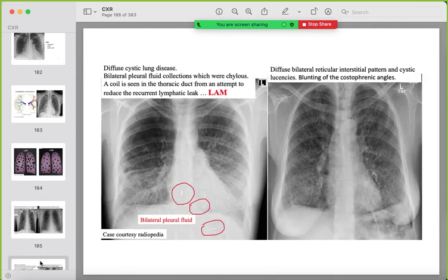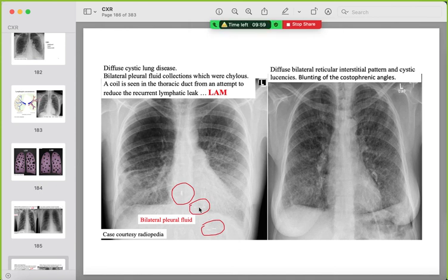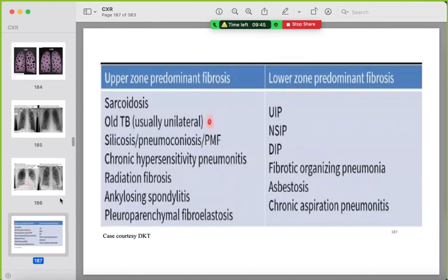In Langerhans cell histiocytosis you can see small and large cysts with scattered nodules, and a faint pneumothorax may be visible. In LAM, other findings include pleural effusion or CP angle obliteration with chylous fluid on tapping, and surgical clips on the thoracic duct track. LAM can also occur in tuberous sclerosis.